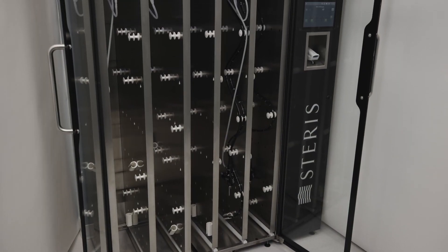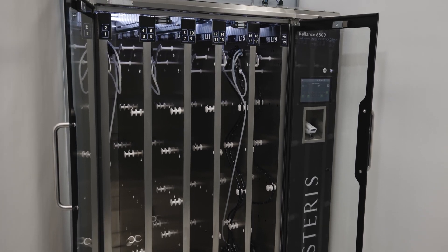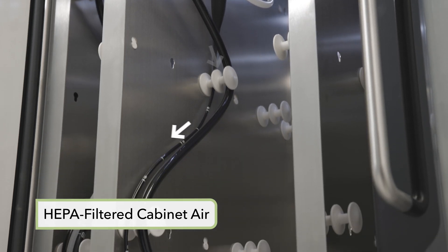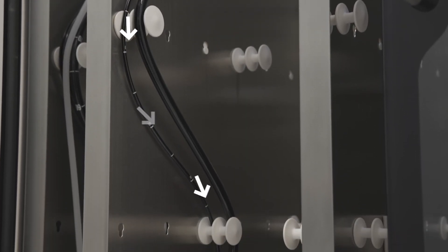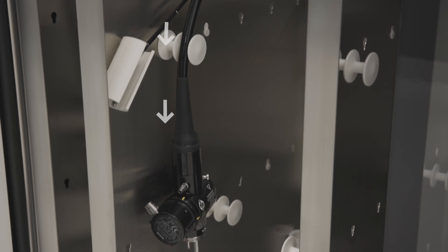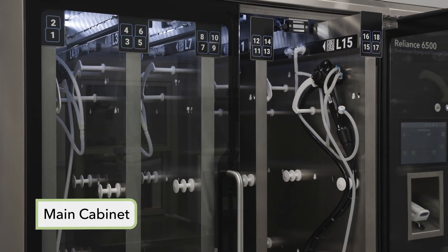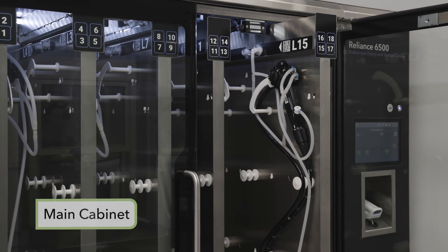The Reliance 6500 Endoscope Drying and Storage Cabinet consists of the following features and components. HEPA filtered air is provided to the inside of the cabinet via ceiling-mounted vents to provide air flow over the stored endoscopes and facilitate drying of their external surfaces. The cabinet incorporates retractable endoscope storage panels, tubeset connections, tempered glass doors, and LED lighting.